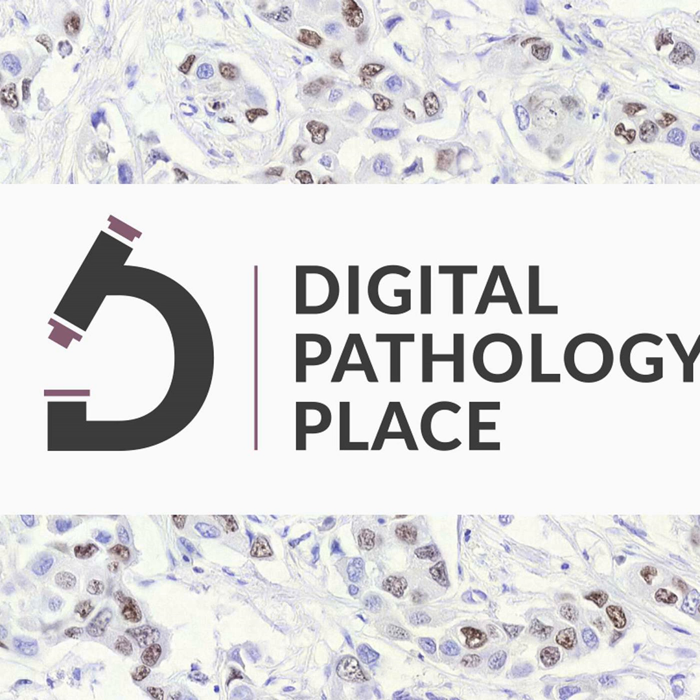Yeah, and on the medical side, you need an experimental pathologist, the EP, who helps define the clinical need and sort of beta tests it. And then the routine pathologist, the RP, they're the end user, focused on usability, ergonomics, how it fits the workflow. Like oversight, I assume? Oh, yes. The laboratory manager, the quality officer, who's crucial for liaising with accreditation bodies and overall departmental leadership. But the one they really highlight is the deployment engineer, the DE.